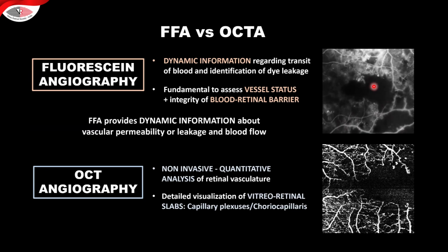and you're looking at the cause because media is clear but the vision is less, so you can do OCT angiography, and if you see that the foveal avascular zone is compromised, it tells you why the vision is less, and you don't need to inject a dye to find that out. So I think this is the most important area where OCTA can be used instead of fluorescein angiography.